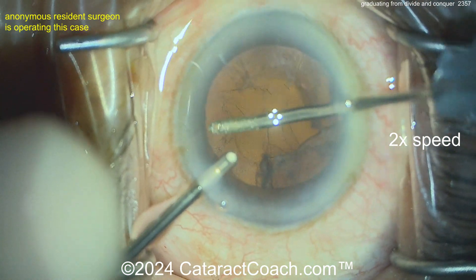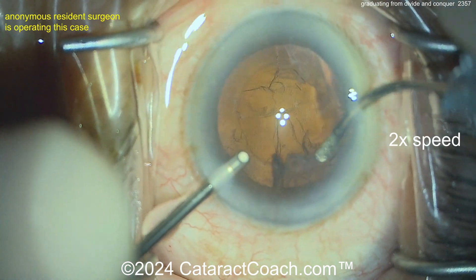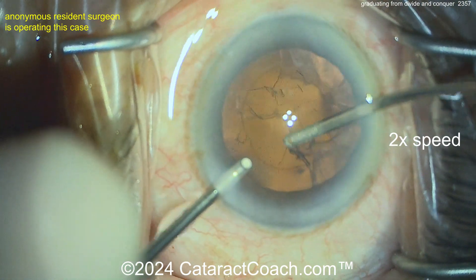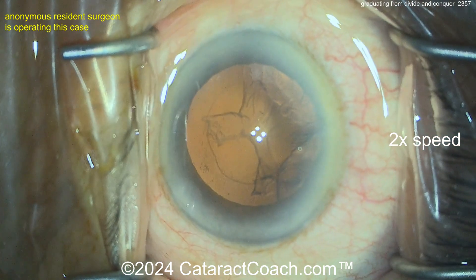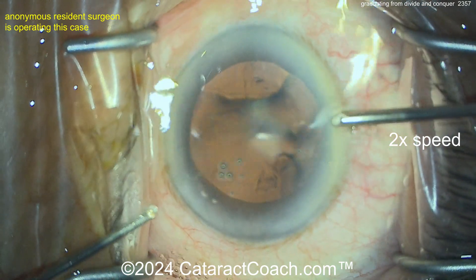So what I think of this case so far: can you make your paracenteses a little bit better — hit the limbal vessel just a tiny bit, I'd like that better — but even then they're fine. I liked your main incision. I thought your rhexis was beautiful.